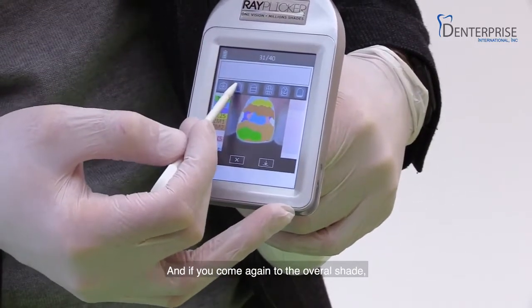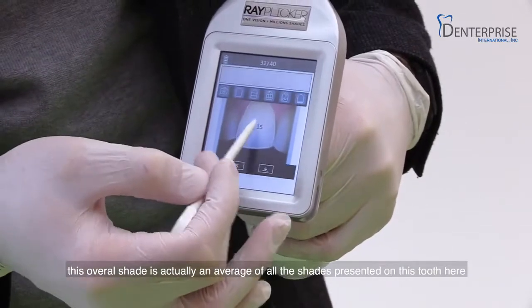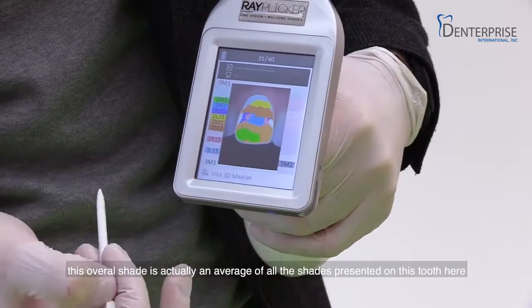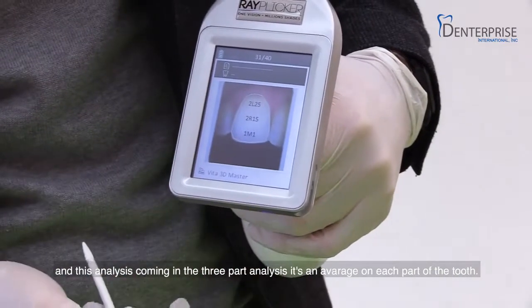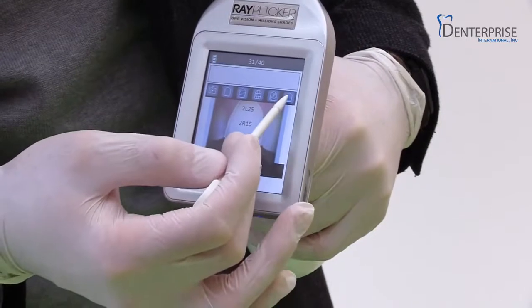And if you come again to the overall shade, this overall shade is actually an average of all the shades present on this tooth here. And this analysis, coming in the 3-part analysis, is an average on each part of the tooth.